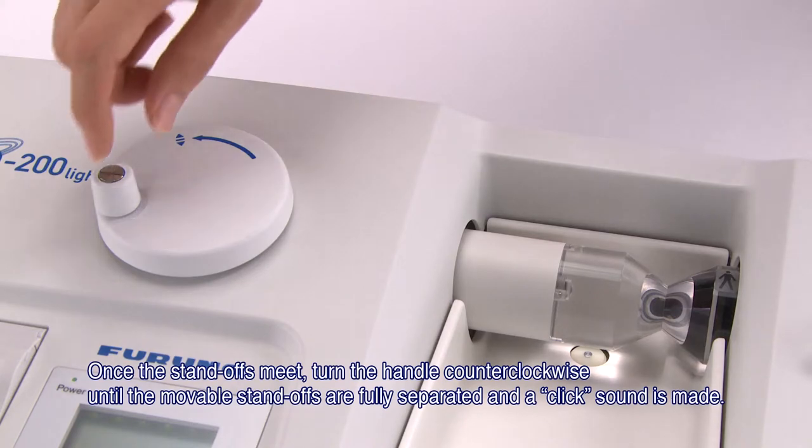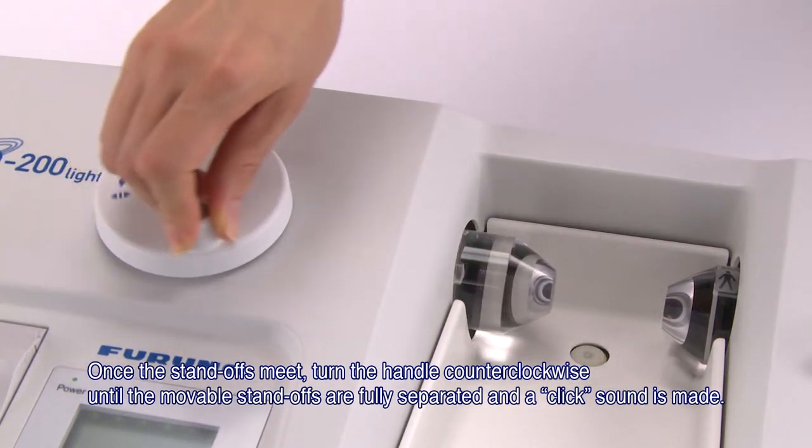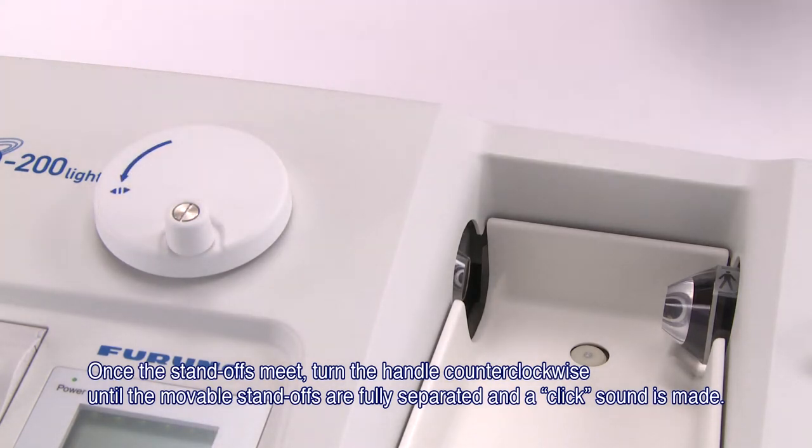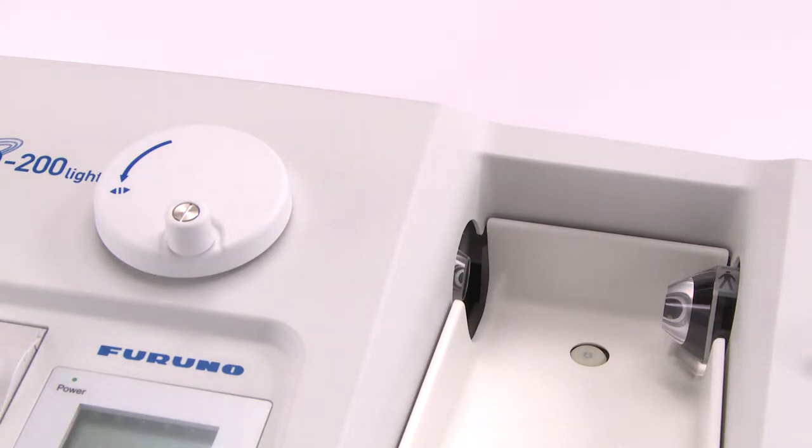Once the standoffs meet, turn the handle counterclockwise until the movable standoffs are fully separated and a click sound is made. This completes the initialization process.